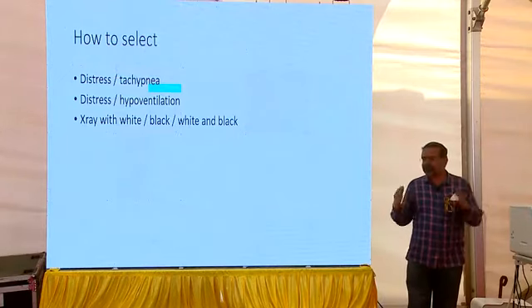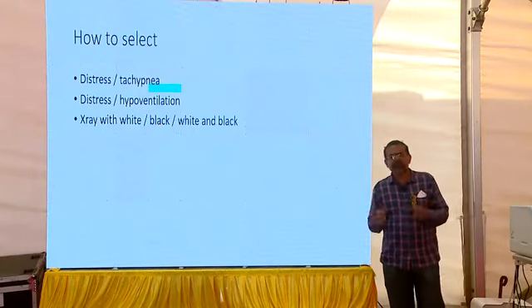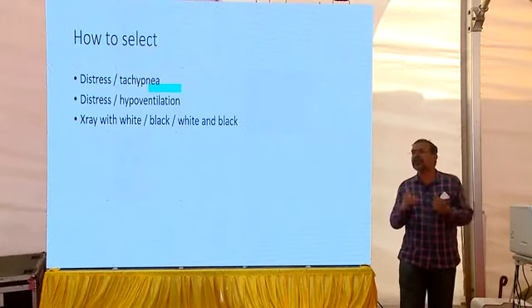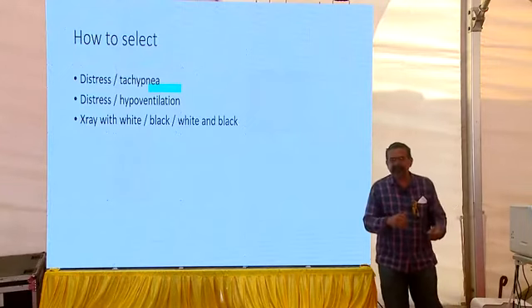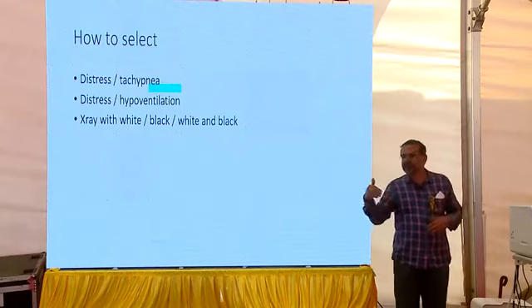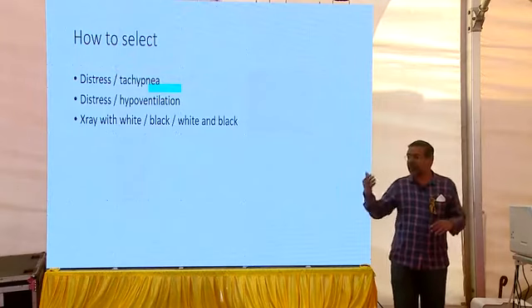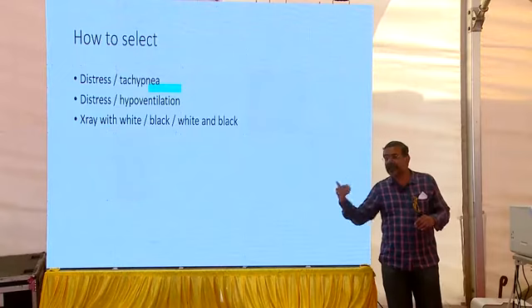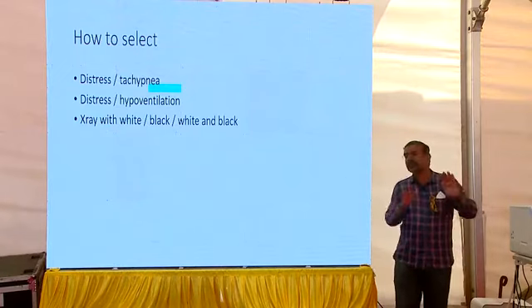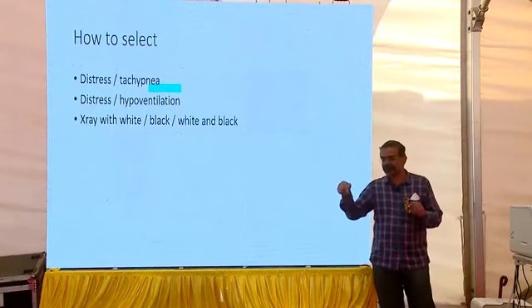Now, the majority of our colleagues may not accept this. Why? Because what I observed is volume ventilation is liked by those neonatologists who practice inborn neonatology. The baby comes quickly, surfactant is received fast, so there is no white-out lung. And those who practice outborn neonatology, where babies come late with white-out lungs, we have to give surfactant very late, at an advanced stage, they don't respond much to volume, they require pressure. So white, pressure; black, volume; black and white, again pressure.